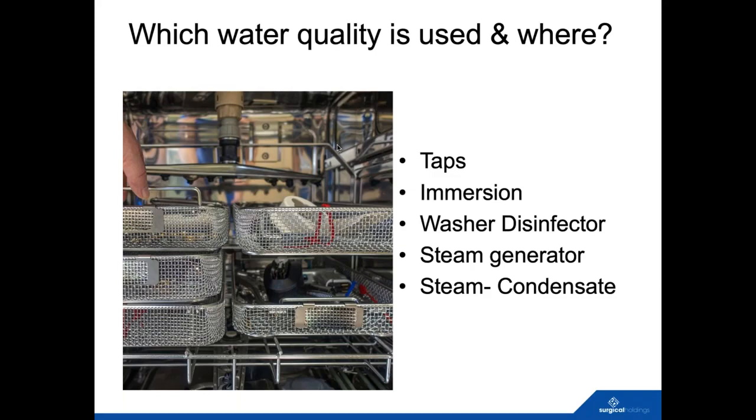Very much so. It's one of the primary issues here in the United States. With water and steam, folks really need to understand how important it is to the life of their instruments. I remind facilities, often we think about capital purchases here. We think about the big items like a Da Vinci or an anesthesia machine or a big fracture table or something in the operating room. But an average 10-room operating theater here in the United States can have a stainless steel inventory between $2.5 and $3.5 million. So often they don't think about that much of the budget being tied up in stainless steel.